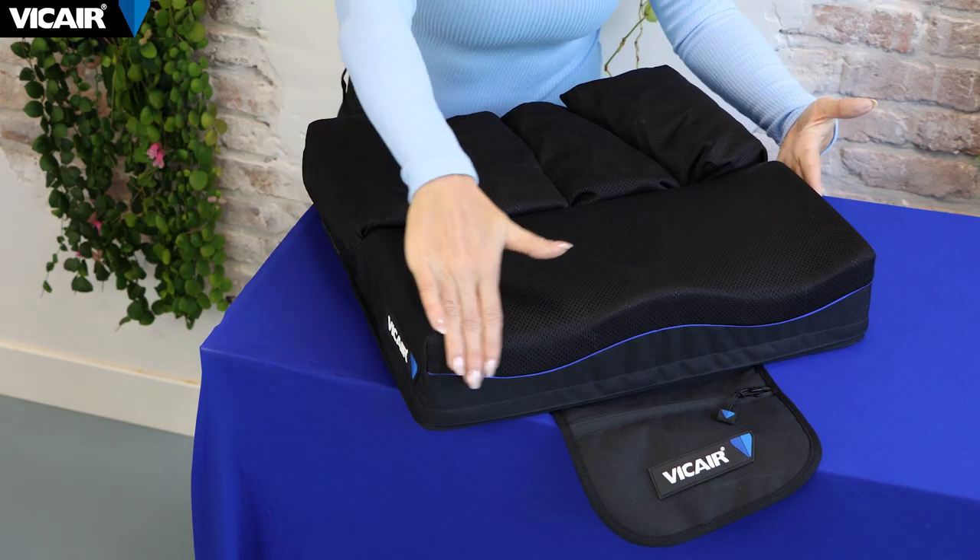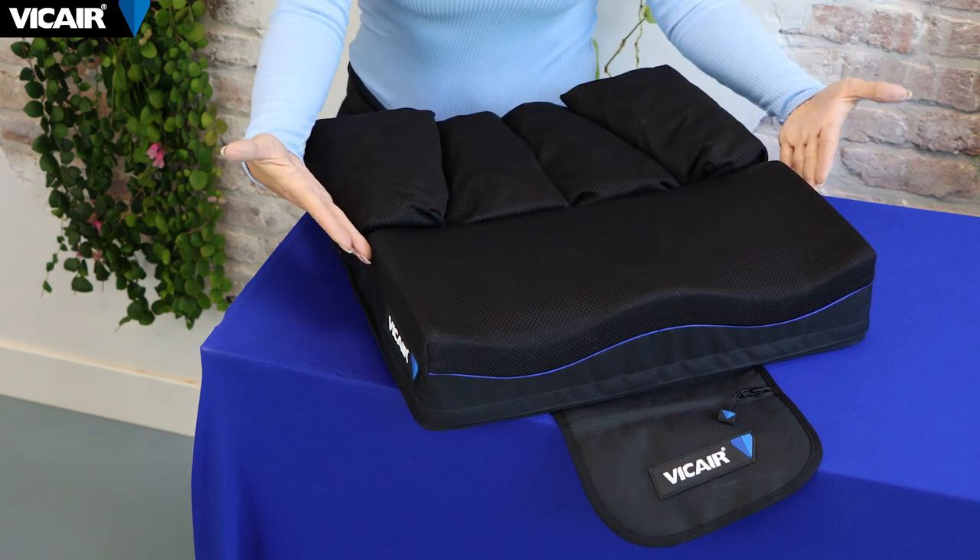In this video I will talk about the features and applications of the Vicair Active O2 wheelchair cushion. The Active O2 is a pre-contoured cushion that consists of four individual compartments at the back filled with smart cells, and an anatomical contoured foam inlay at the front. The smart cell filled compartments are designed to influence specific areas of the pelvis.